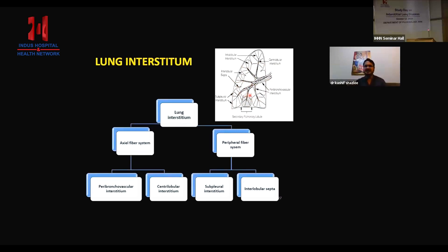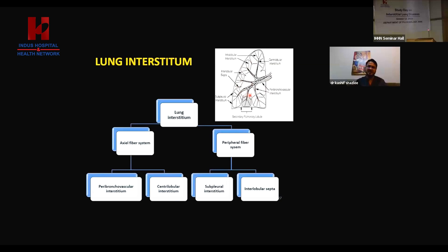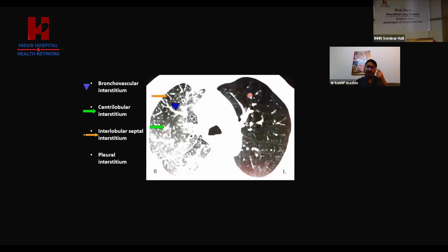Diseases which involve airways and diseases with infective etiology most of the time start from the parahilar region and go from central to peripheral. Plus with HRCT, if there is ILD, most of the time it is bilateral; whereas infection, most of the time it is unilateral. These are some important points to keep in mind while reading HRCT.